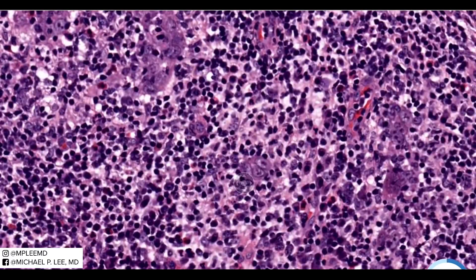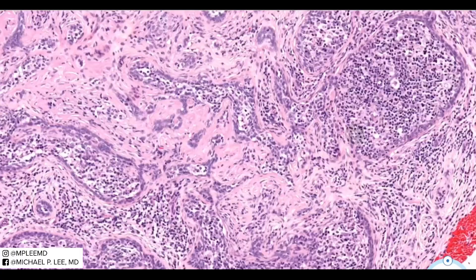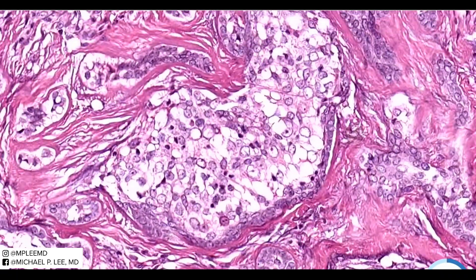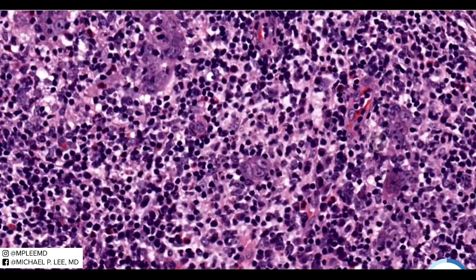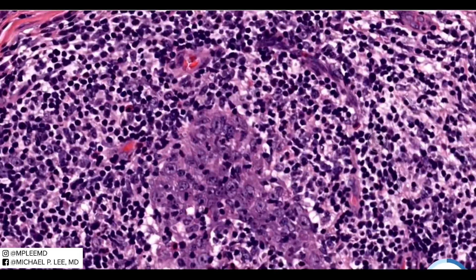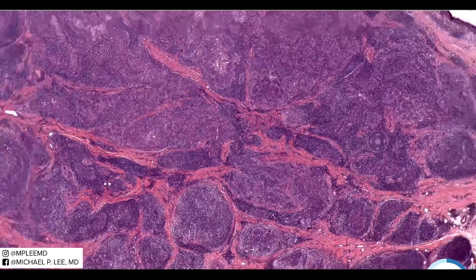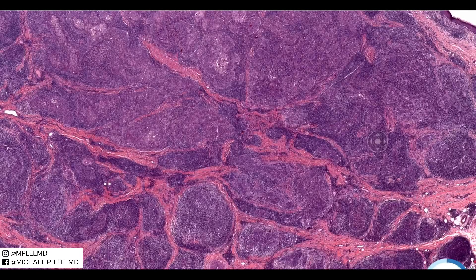Looking back at our cutaneous lymphadenoma, it's quite different — the actual tumor cells with vesicular nuclei are almost uniform in shape and size, all round, with no bubbling-out of the nuclei, as opposed to lymphoepithelial carcinoma where the cells are much bluer and far more pleomorphic. Lymphoepithelial carcinoma is probably the main entity to be confused with cutaneous lymphadenoma.